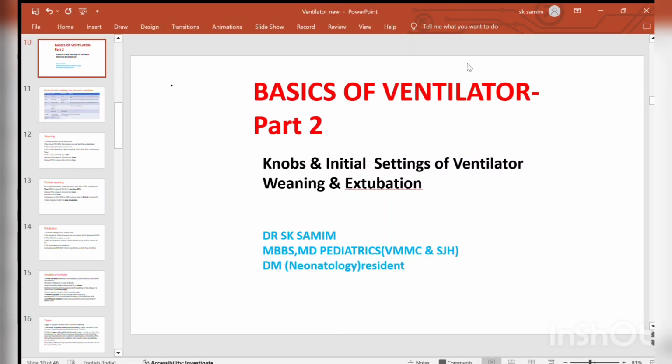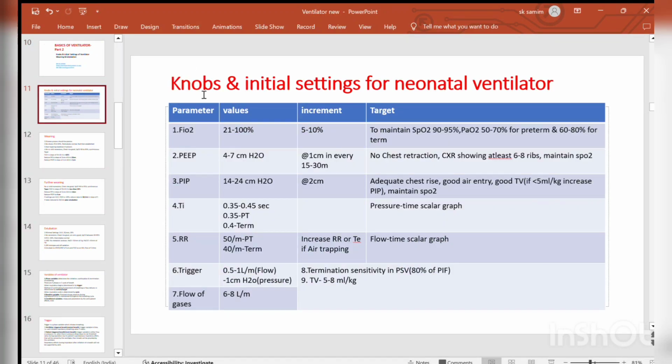This is part 2 video of basics of ventilator. Here I will discuss the knobs and initial settings of the ventilator, weaning and extubation. There are different knobs in the ventilator.